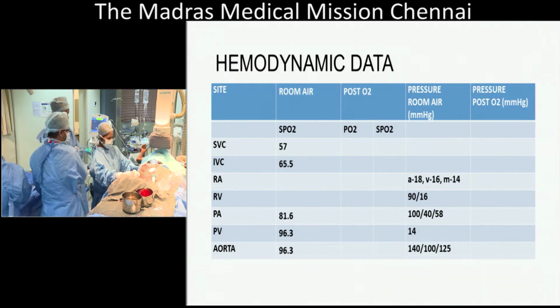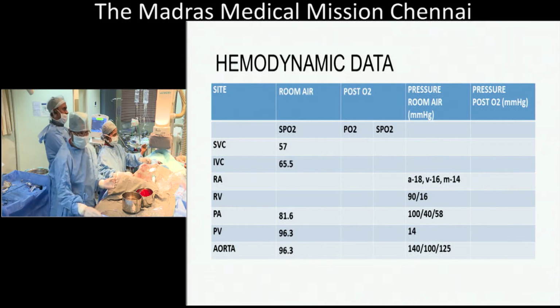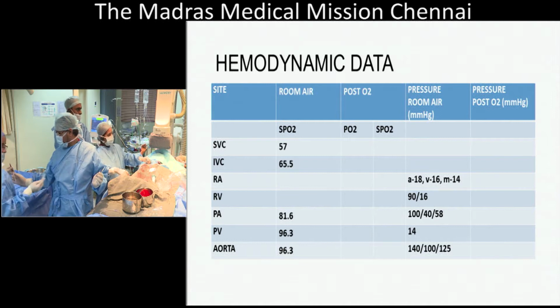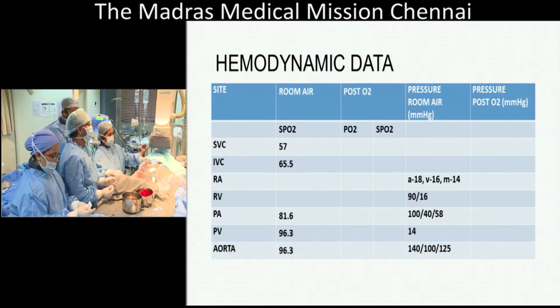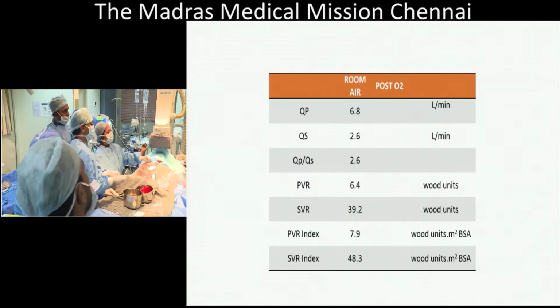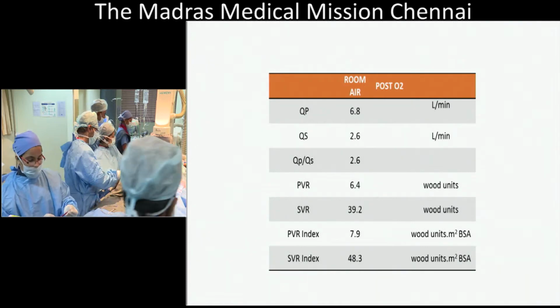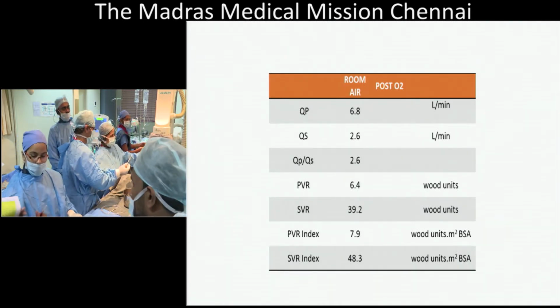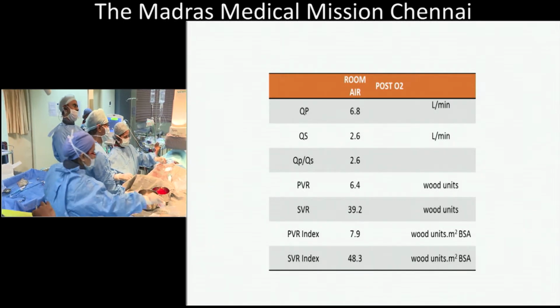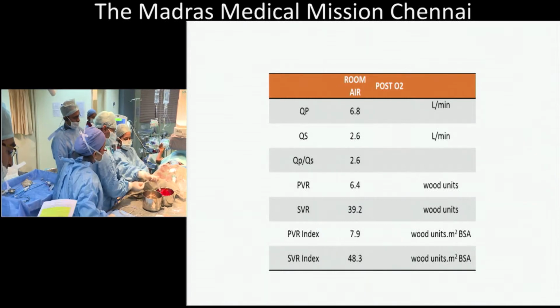In the audience, show of hands, those who would close this defect with a normal, non-fenestrated device. Normal. Okay. Good. And those who would use a fenestrated device. Well, that's very helpful. It's 50-50 for you. So you'll have to phone a friend now. Jae Young's got a question or comment to make. Jae Young?